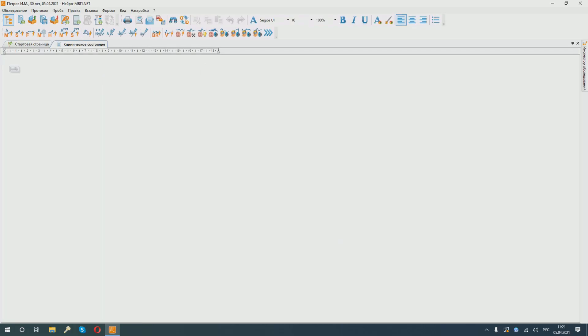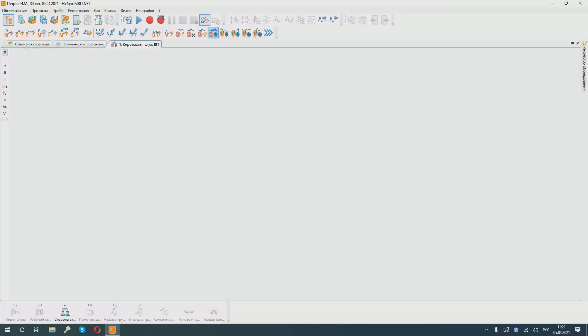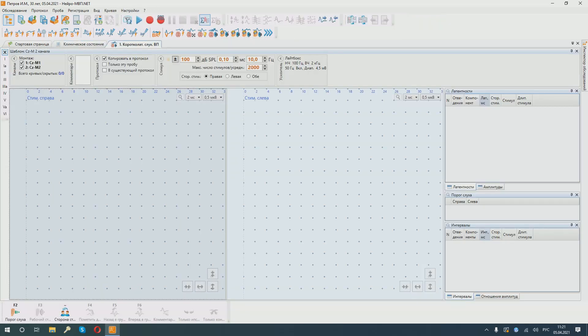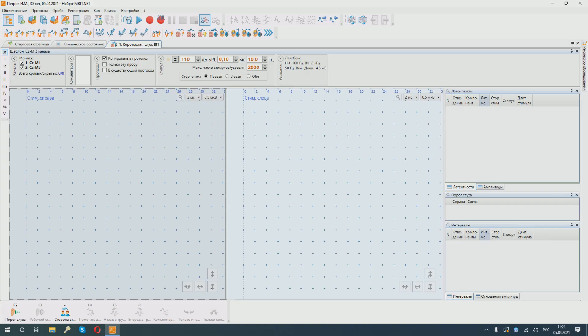Select the test we need. In this case, it is short latency, stem auditory evoked potentials. We get to the sample window for this technique. We see our montage and stimulation parameters. In order to correctly estimate latency and interpeak intervals, peak amplitude, we need to conduct a rather high superthreshold stimulation. We choose the necessary intensity.